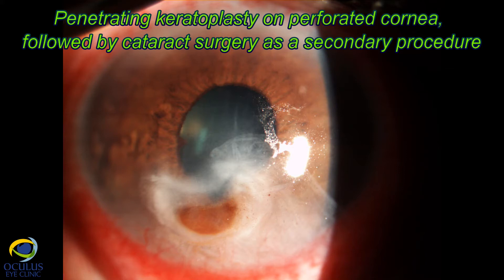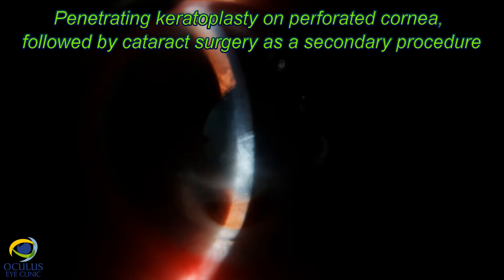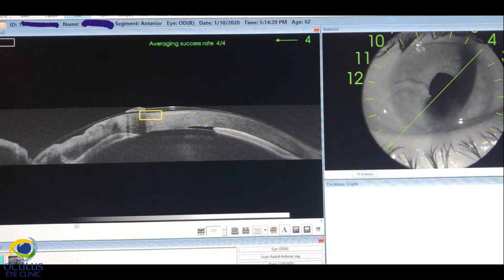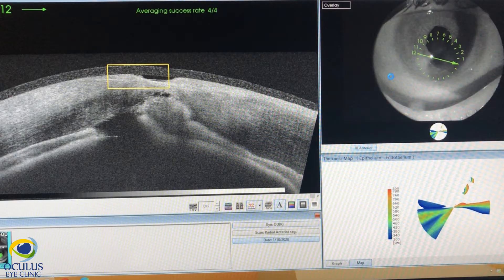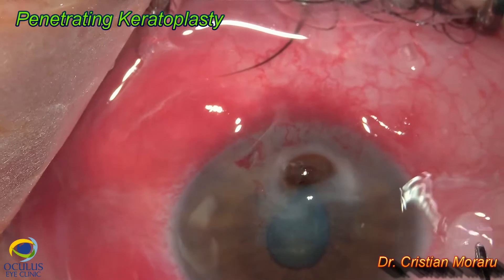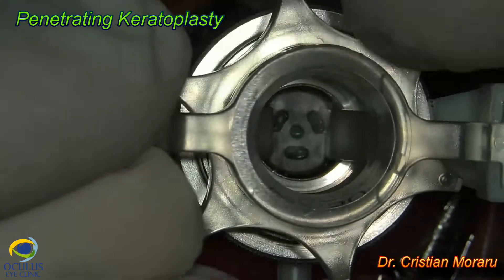This is a case of a 58-year-old patient who came to us seeking penetrating keratoplasty surgery on a perforated cornea after a corneal abscess. The patient stayed in a hospital in another city for one month with medical treatment only and a therapeutic contact lens. The eye is perforated and the perforation is closed with the iris, and he has completely lost the anterior chamber, as seen on the OCT.